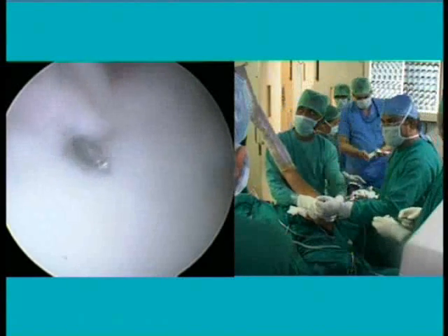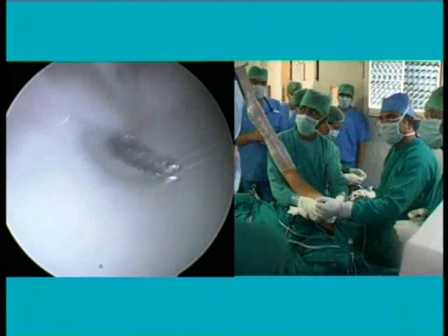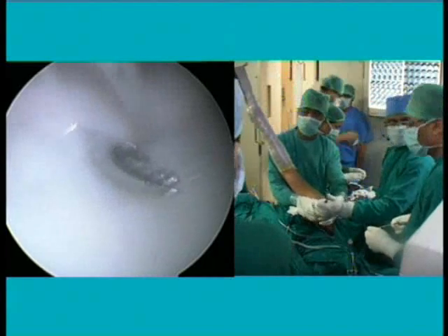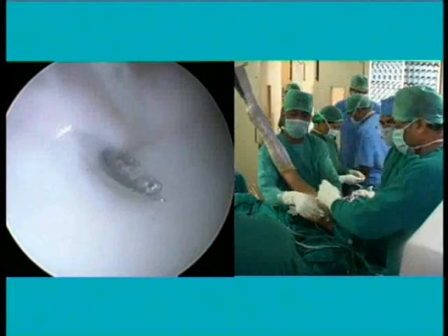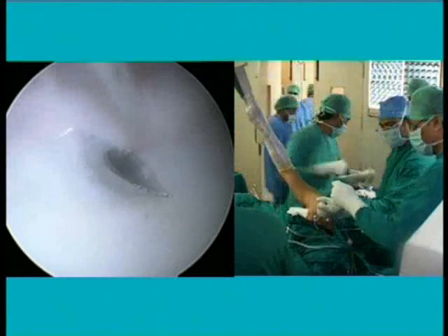And now the drill is fast. Since it's a variable angle, we are able to adjust the angle so that we are right at the dead center of the clavicle.